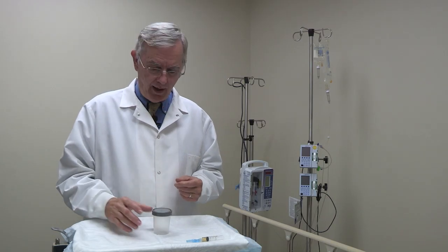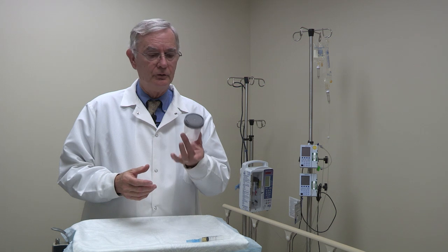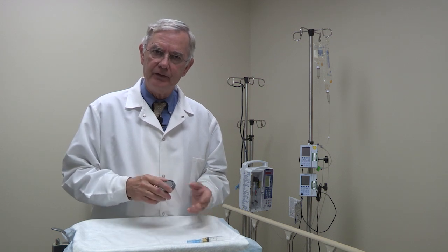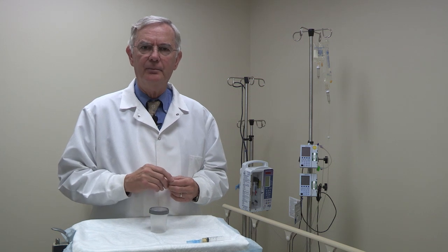Most of our specimens arrive in a sterile, screw-capped urine specimen cup. But some specimens may be collected from the port of a urinary catheter, and others may be collected by a straight in and out catheter by the physician. All of these would arrive in the sterile specimen cup. The microbiology lab will note the source. For collecting from catheters and the use of straight catheters, specimen collection should be performed by healthcare personnel who have completed training and demonstrated competency.